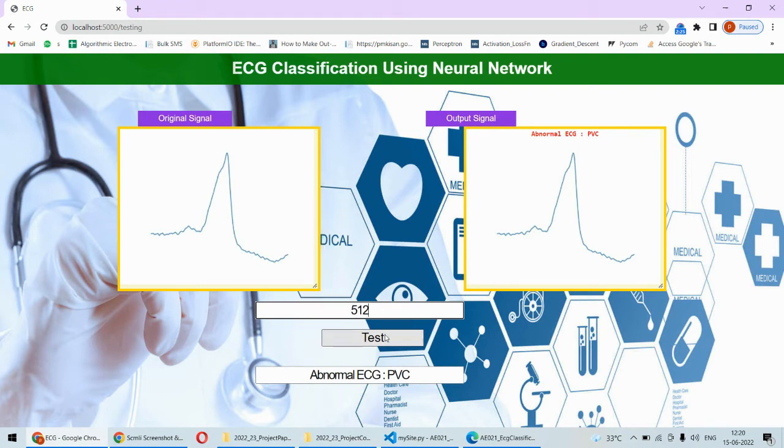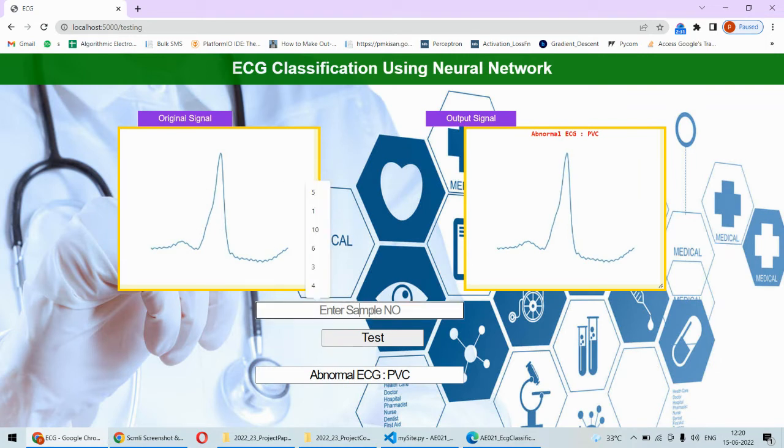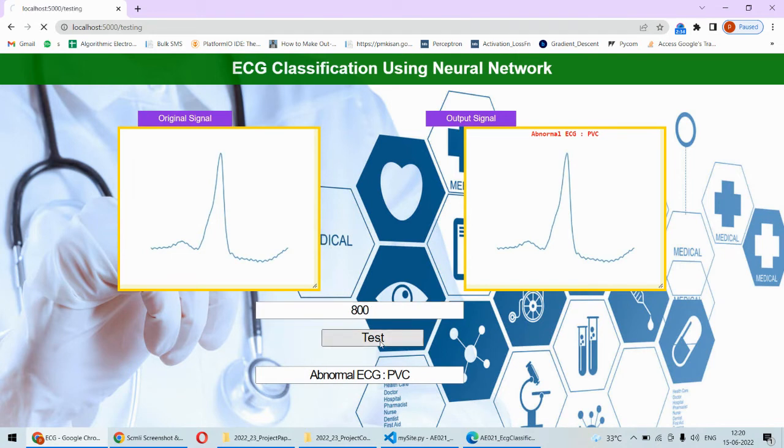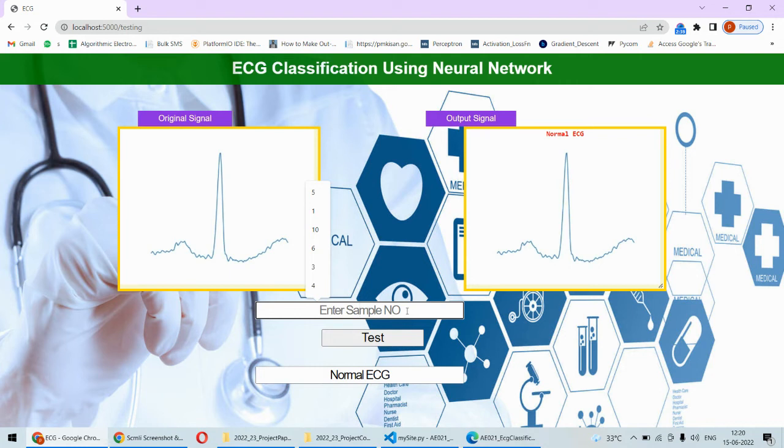For example, if you detect write 512 number of sample, then that sample will be fetched from the memory and whether it is normal or abnormal that is detected. So different samples you can pick. This is the normal ECG we can consider and we can actually find out whether that is normal ECG or abnormal.